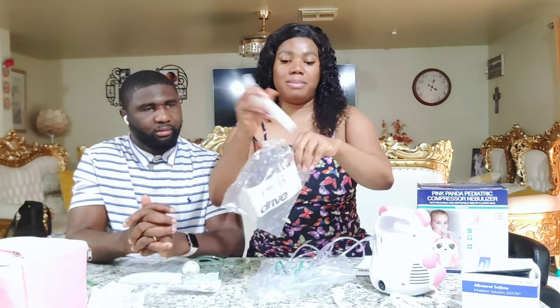Yes, are you ready, Ava? So right, we're gonna adjust this according to her. I'm gonna turn it on. You can see the mist. It's okay. No, I'll hold it for you. What happened? Oh, see, it came off. I don't know if you can sit and just hold her. No, it's still going to her eyes, but you keep doing it like this, pressing on his head. If you need to pause for whatever reason, just turn it off. It doesn't matter.